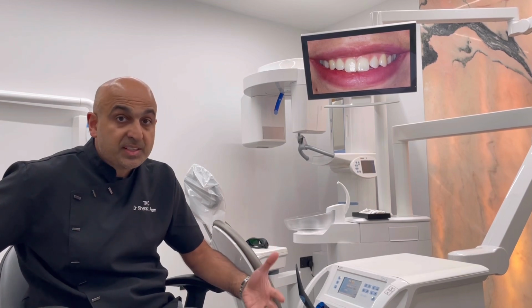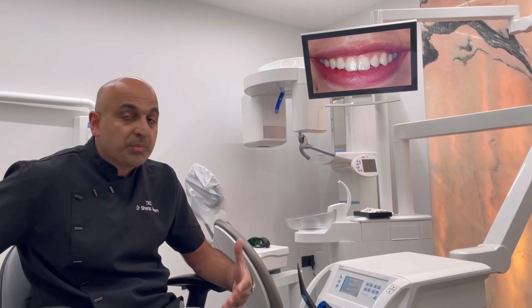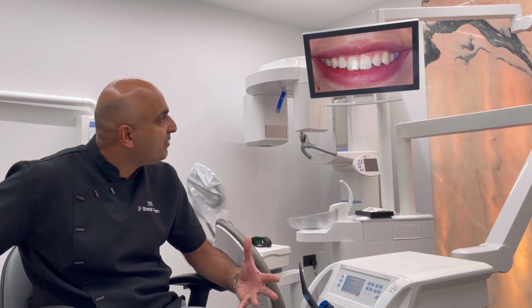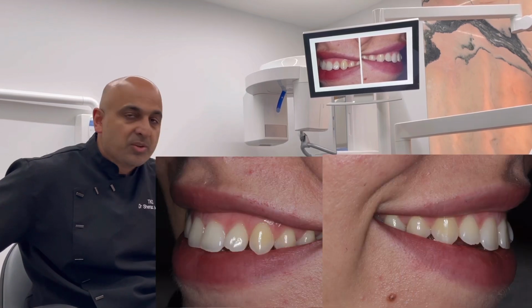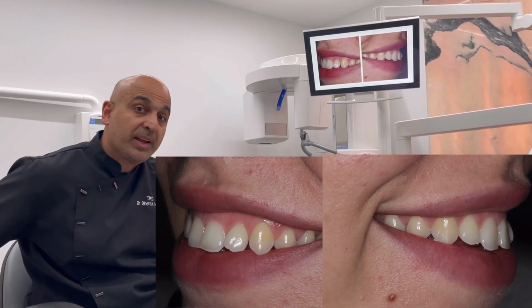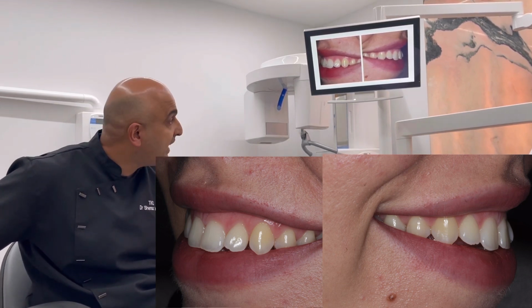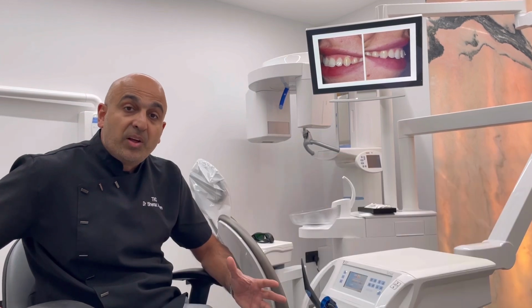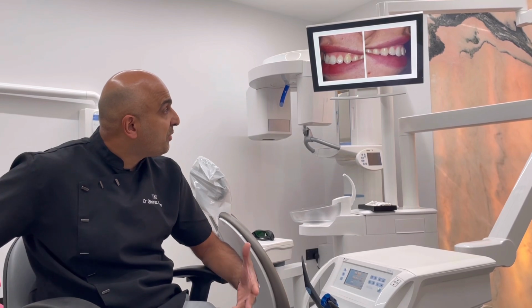Both options were discussed with the patient. The patient opted for composite bonding just to get these teeth to look more like lateral incisors rather than what they look like now, which is very rounded but short teeth. Again, you can see from these pictures there's quite a bit of proclination. Invisalign is quite good at improving that. With some attachments onto the teeth, we're able to pull the teeth back in and close the spaces up slightly. You can see here this tooth was really sticking out. It bothered the patient quite a lot, so we were able to fix that relatively easily with the Invisalign. It only took 3 to 4 months.